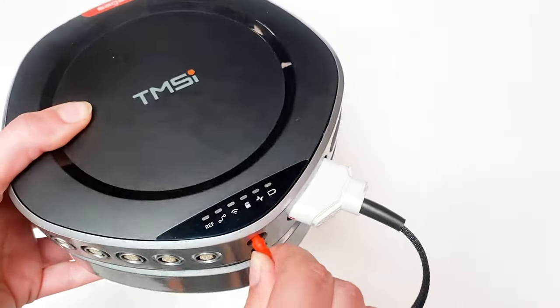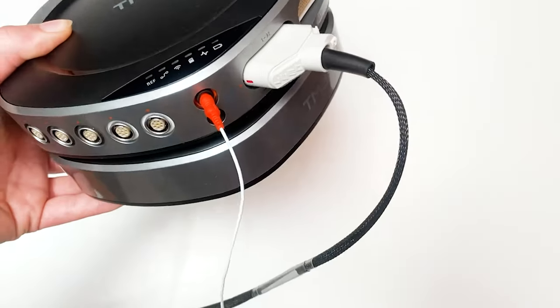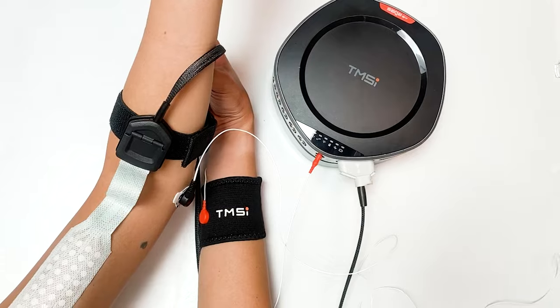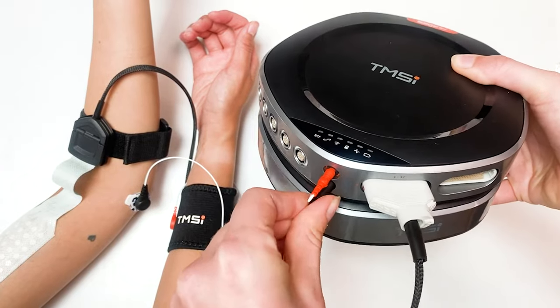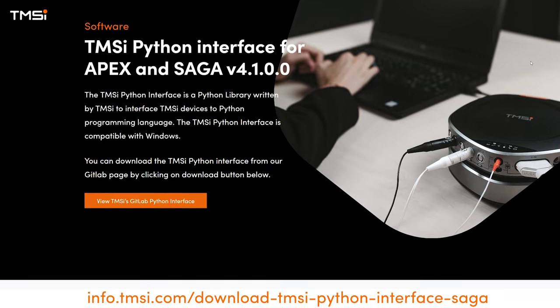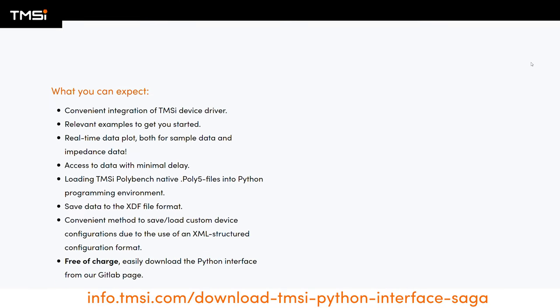Plug in the cable of the patient ground electrode to the data recorder. Optionally, it is also possible to connect a common reference cable if you would like to use one for your measurements. Check the impedance and configuration of the TMSI Python interface and you're ready to start your measurement.